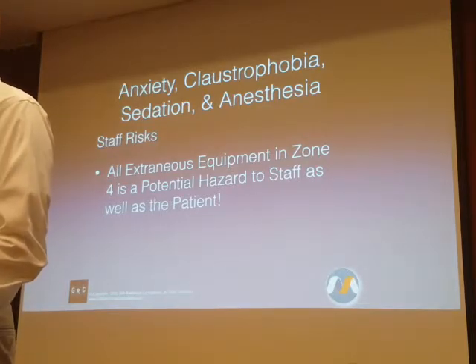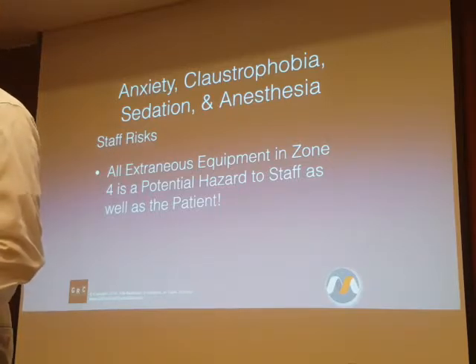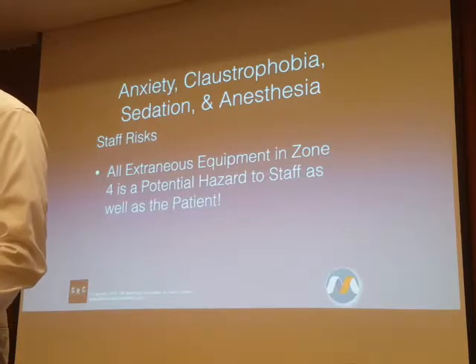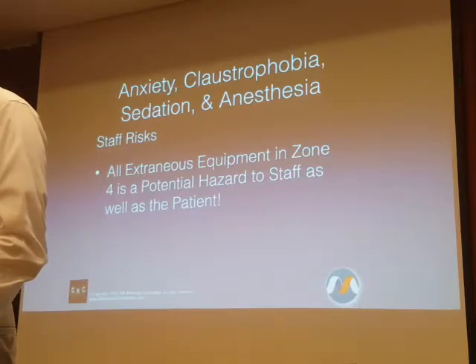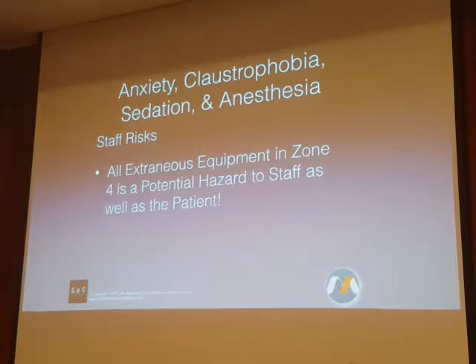So we need to be concerned with respect to anesthesia, but anybody else who comes into the MR environment, concerned with respect to their equipment to make sure that it is appropriate to the environment, because it is not only the patients who are being put at risk, it's the radiographers, it's radiology nurses, it's anybody else that's in the room as well that is potentially at risk.